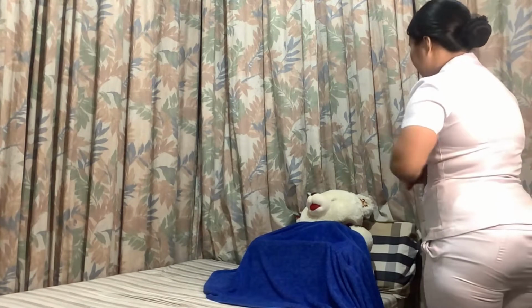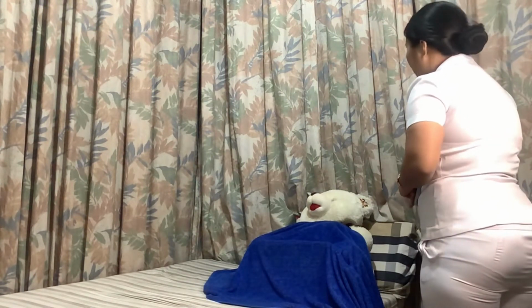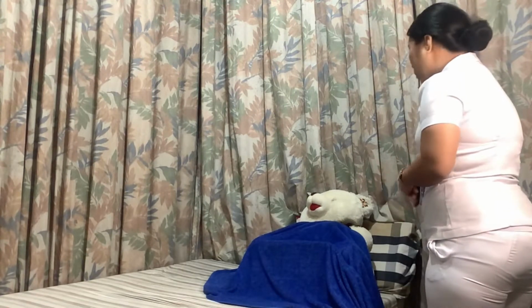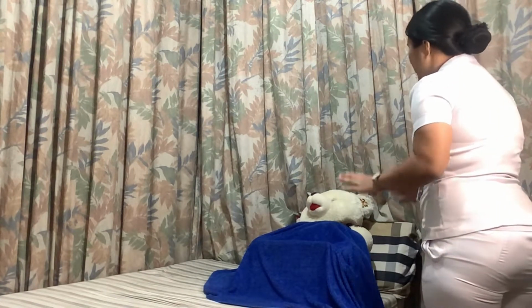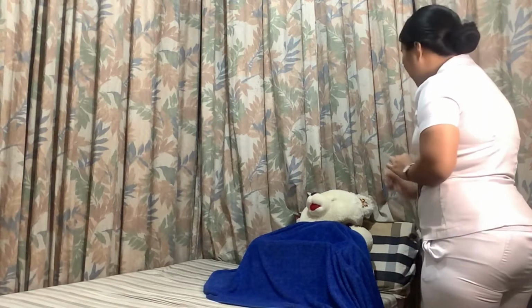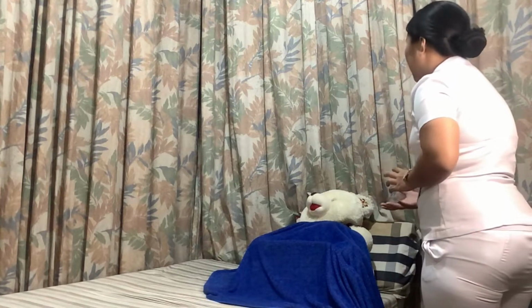Good day, ma'am. I'm Jess Alfaro, your student nurse for today. So for today, ma'am, I'm going to perform a catheterization. And I'm going to expose your genital area. Will that be alright for you? Okay. Since you can control your urine and empty your bladder, I'm going to insert a catheter there. And this is how to drain your bladder, okay?